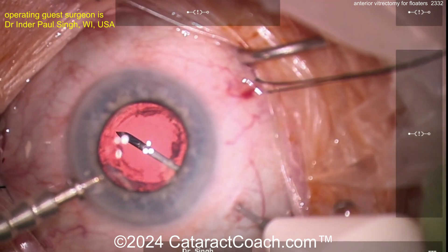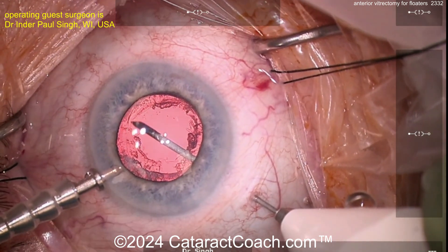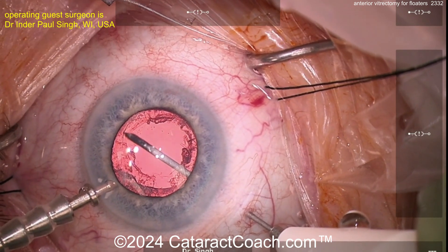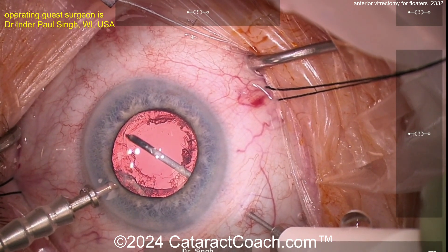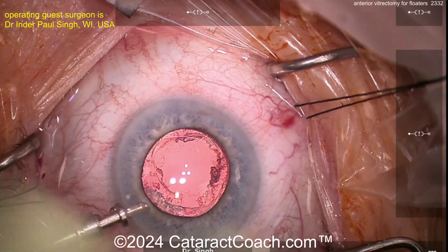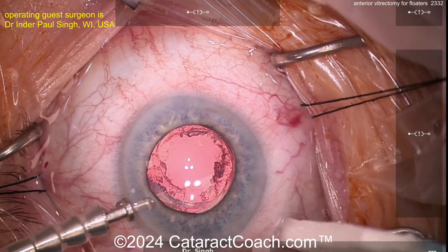Now I feel I've seen all the floaters I can — they look gone, the media looks very clear, I feel pretty good. I'm going to come up anteriorly just for a few more seconds, cut cut cut, make sure nothing is attached to the tip. Once I feel nothing is attached to the tip, I come out — and there you go.